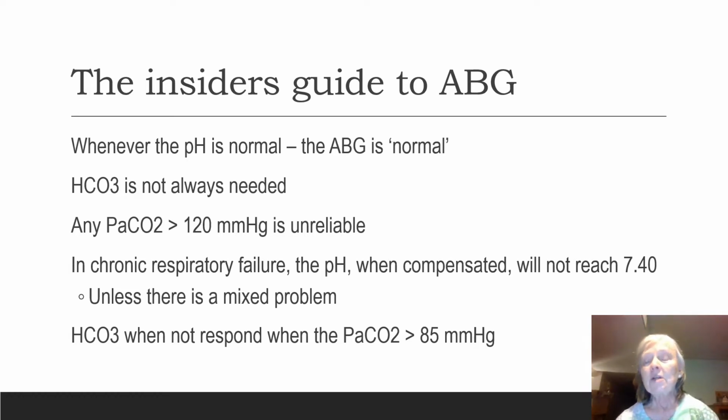Okay, so there's a couple of ABG sheets I'm going to go ahead and put onto Blackboard and have you guys do interpretations with them. Part of the interpretation is going to be whether the patient is in respiratory failure, and if so, what the type or types of respiratory failure for that patient. The other thing is, remember, there's two parts to an ABG. There's the acid-base balance, and then there's the oxygenation. All of the ABGs have to have an acid-base balance and an oxygenation with it.